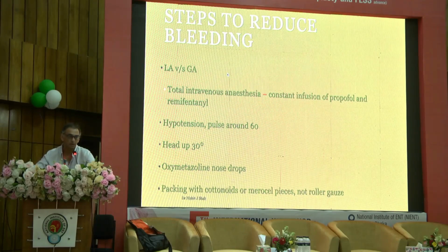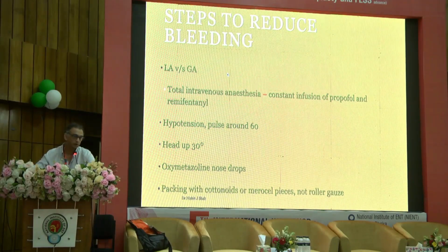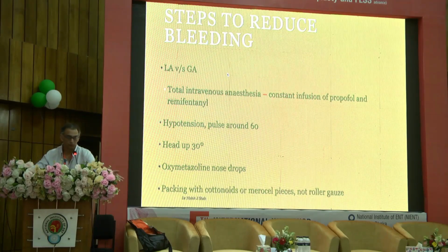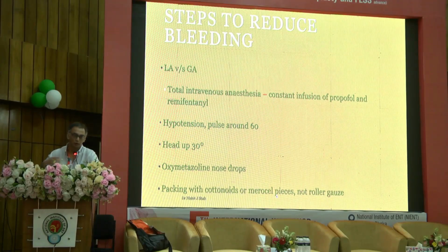Today I will do everything under GA. Everything, nothing under local. Even a DCR will be GA, given to me the option. Just because our anesthetists are able to control the blood pressure much better, able to control pulse better, and we have switched now from inhalational mainly to IV anesthesia. So we don't get so much of vasodilation. Okay, so we generally tend to pack with cottonoids or Merocel, not roller gauze. Roller gauze is abrasive and it should be avoided in the nose.